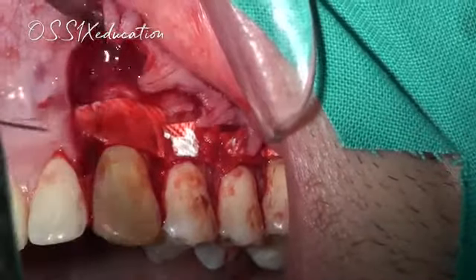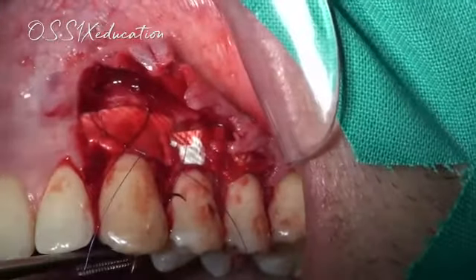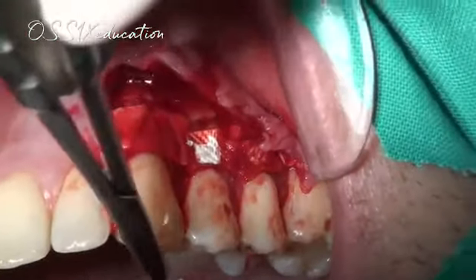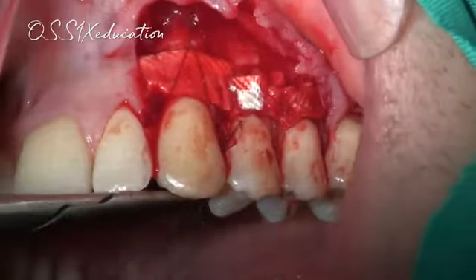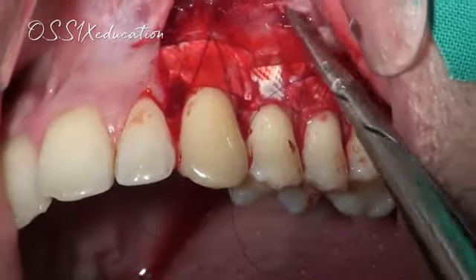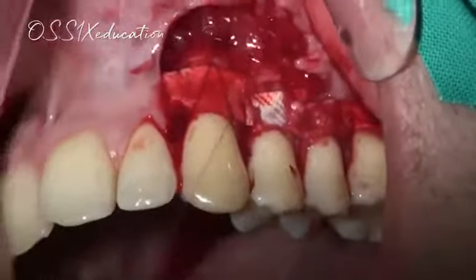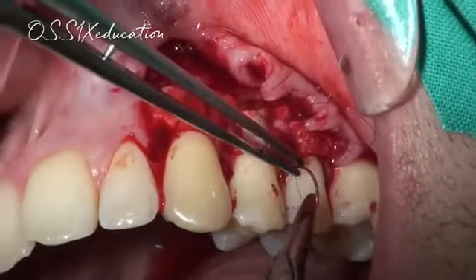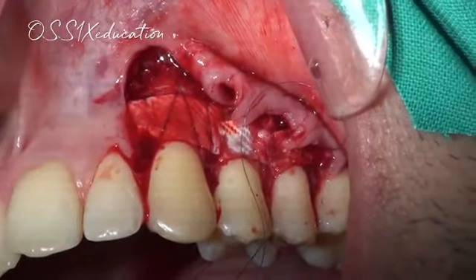I like to stabilize it with cross mattress sutures, where we go from the palatal area through the periosteum. So we do these cross mattress sutures, and I use the 6-0 Prolene suturing material. For me, this is the best material there is. I've been using it for the last 17 years. I've never seen a stitch abscess. I've never seen an infection. I've never seen inflammation around it. There's almost no plaque accumulation on it. So for me, this is the go-to material in all of my periodontoplastic surgery procedures.